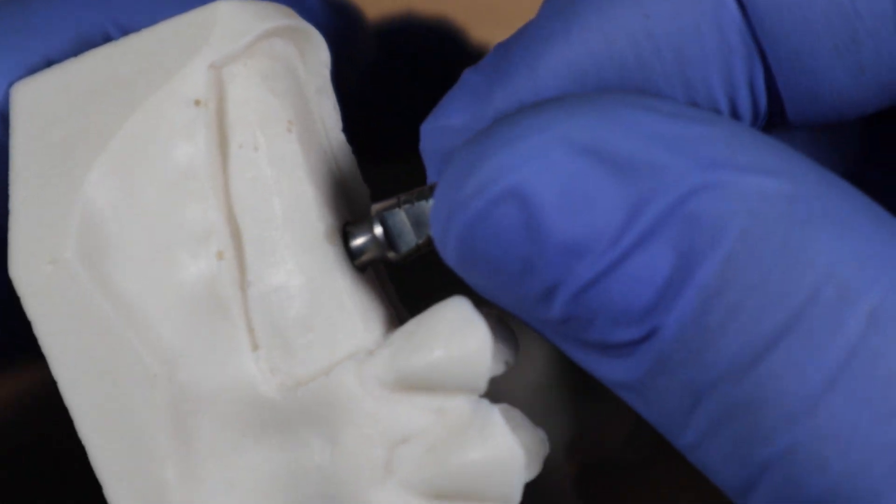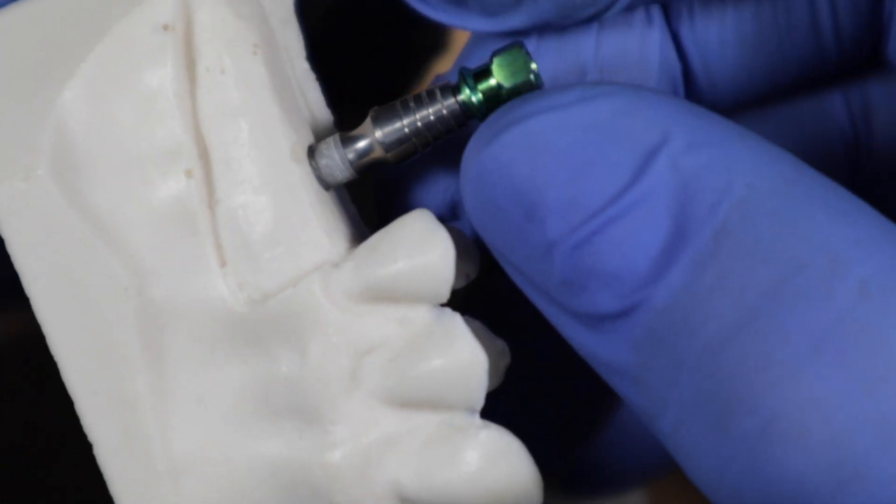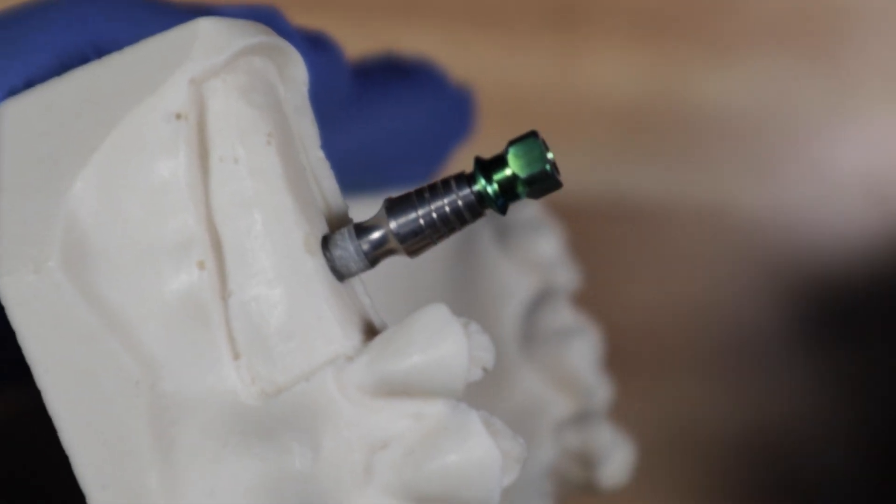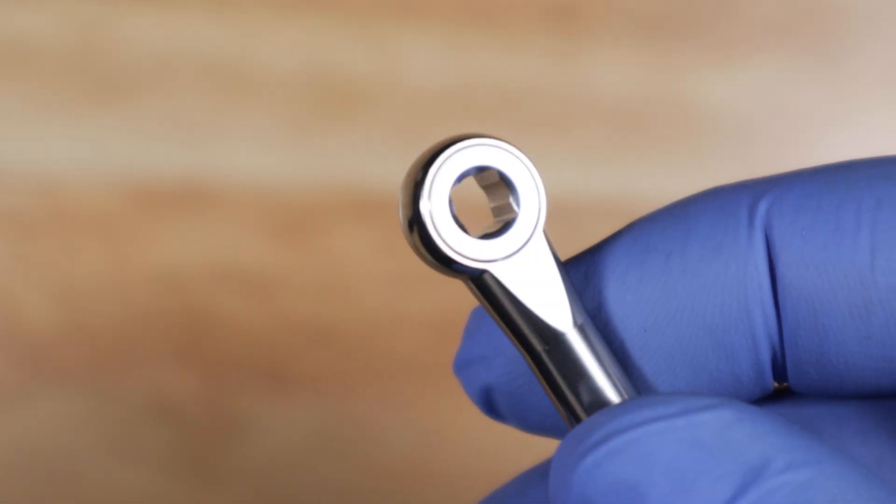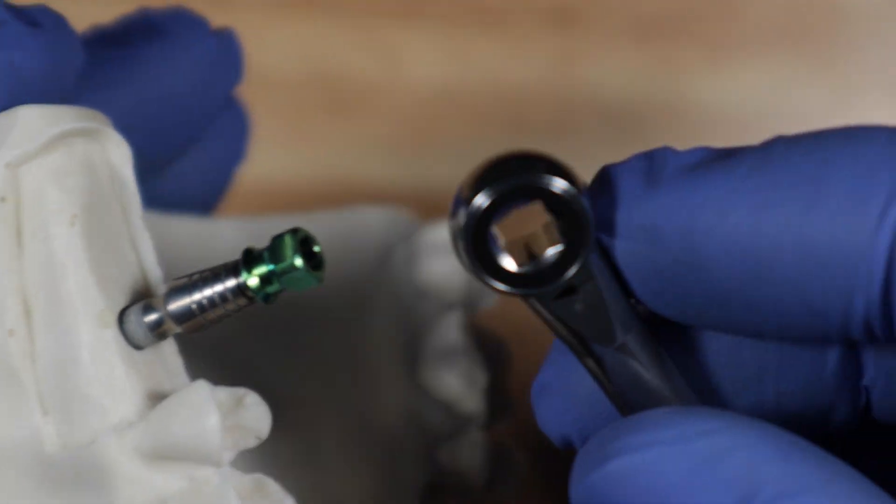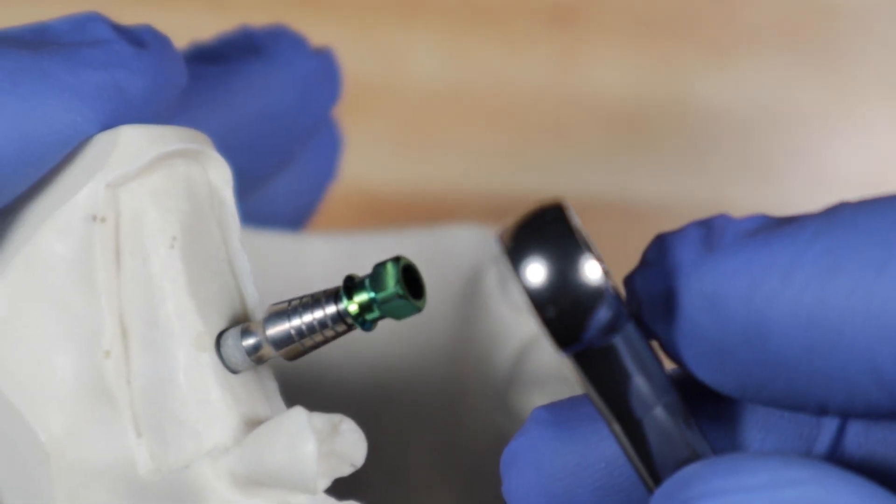And often actually your implant wouldn't have gone all the way down. Your implant will be like right there. And then you just take your torque wrench, this guy right here with the arrow visible, and then you put your torque wrench on there and take it the rest of the way.